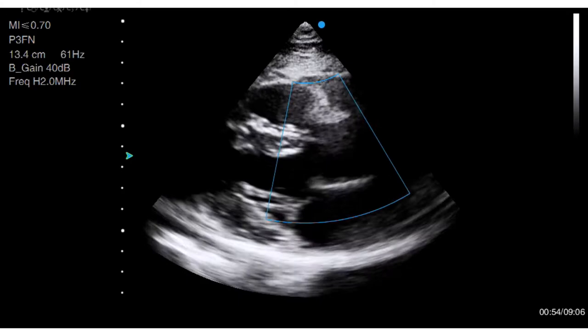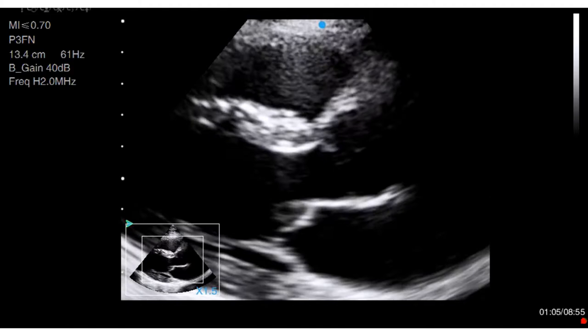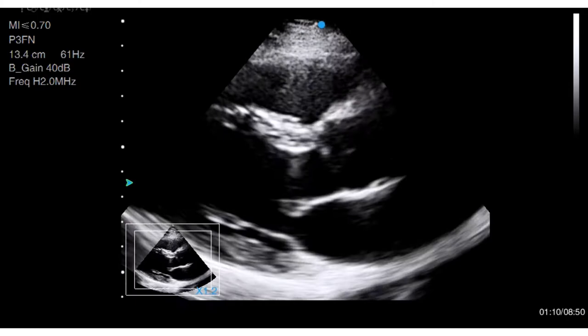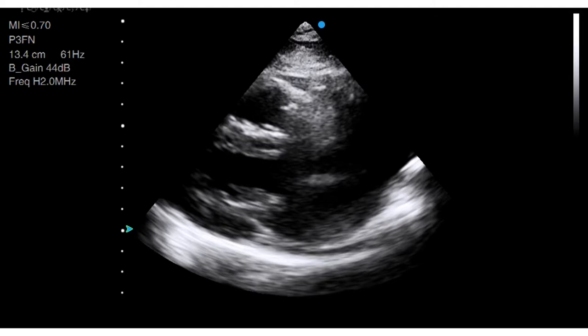That would be very important if you were performing an in-depth investigation on a boxer, for example, whom you might suspect of having congenital aortic stenosis. But for now, just use this view to look at the outflow tract. Is it uniform in diameter or does it come in like an hourglass, potentially causing some obstruction to flow? Do the valve leaflets open freely and widely or are they restricted? And if you can see beyond the valve, as you often can in dogs from this view, have a look for any narrowing.